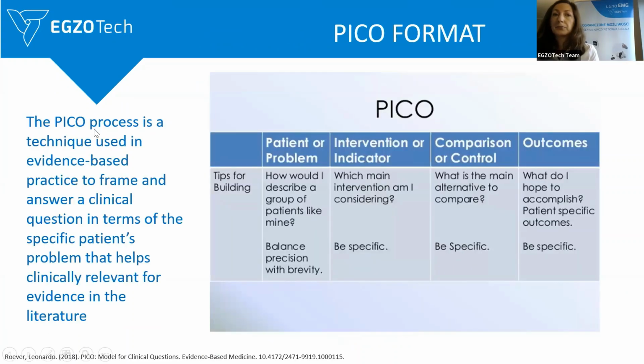When thinking about the research, we think also about the study design, on how we would like to plan the study, what we are going to measure, who our target group is, how we can organize the intervention. And for that, very useful might be the PICO format.